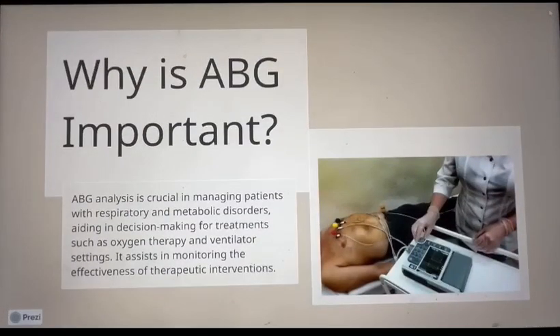Why is ABG important? ABG analysis is crucial in managing patients with respiratory and metabolic disorders, aiding in decision making for treatments such as oxygen therapy and ventilator settings. It assists in monitoring the effectiveness of therapeutic interventions.